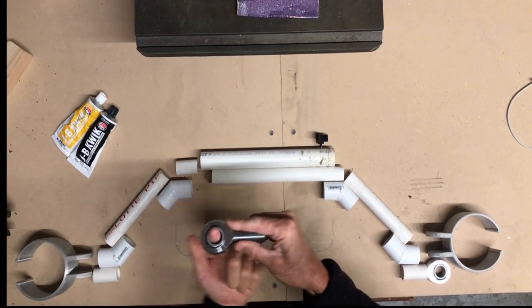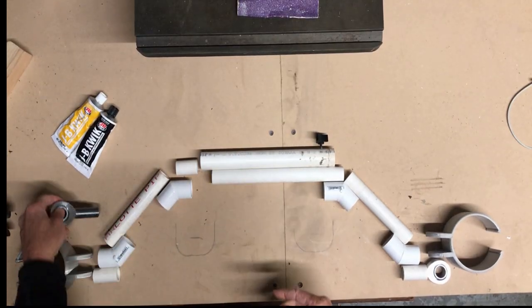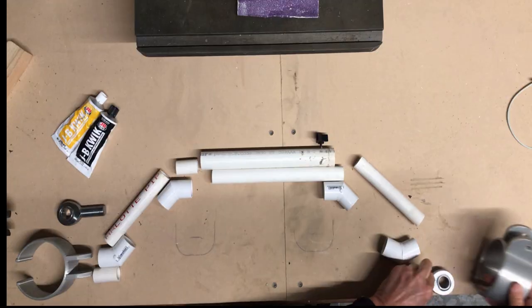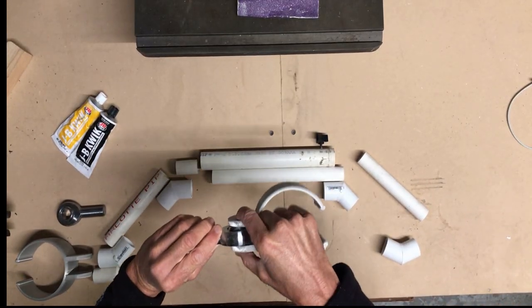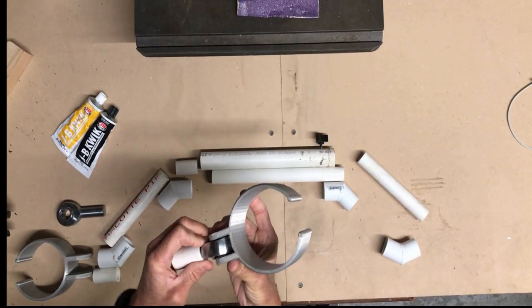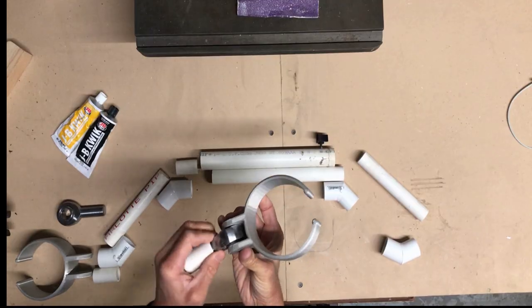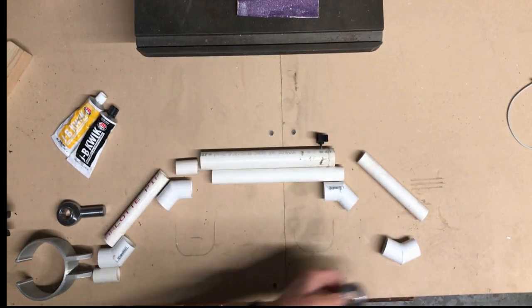When it goes back and forth it allows it to swivel, but in this case we're gonna use it here and we're gonna put this cuff on it like so. It's gonna allow the cuff to have a little bit of swivel in there, so there's gonna be some minor adjustments before we get there, but you get the idea.